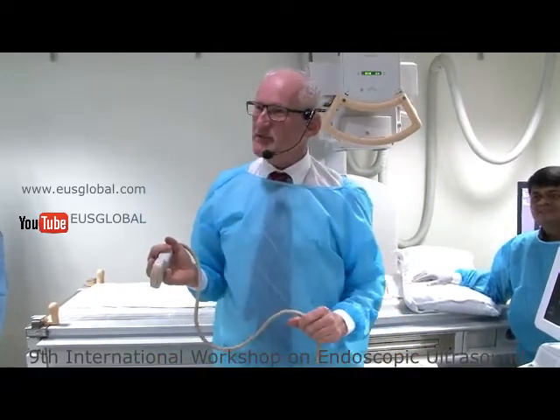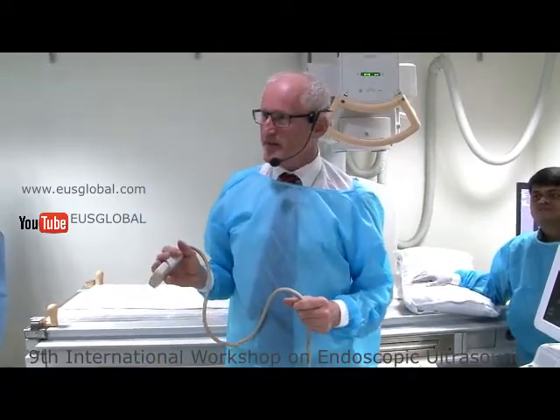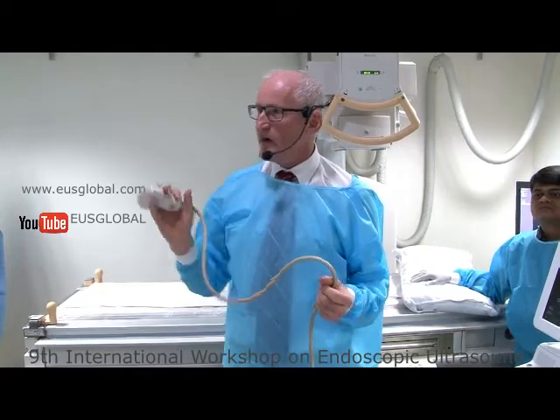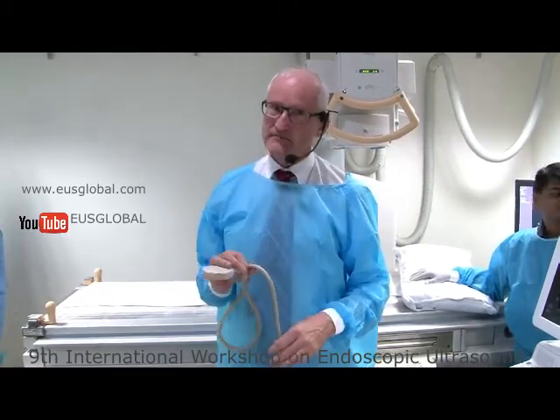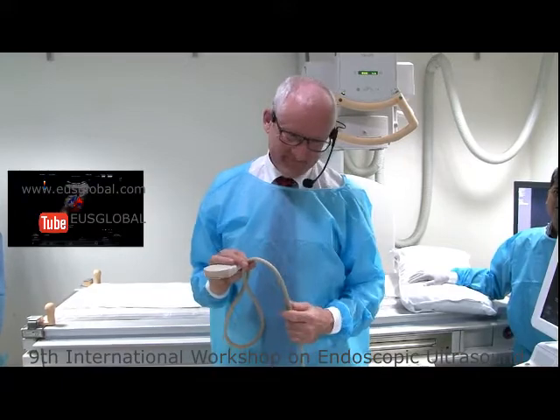That would be my part from the transcutaneous ultrasound. I guess right now we will change to endoscopic ultrasound to see all that from a closer view. Thank you so much.